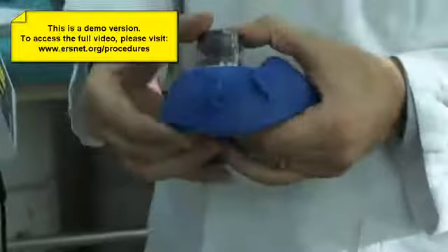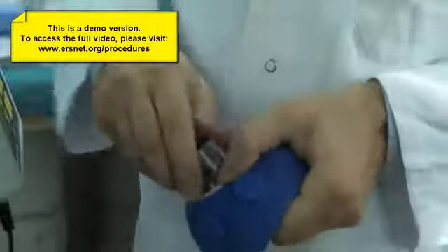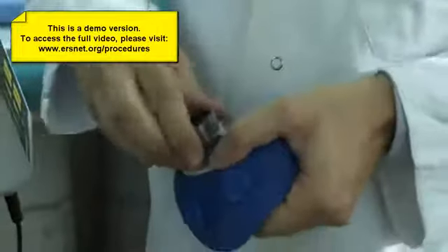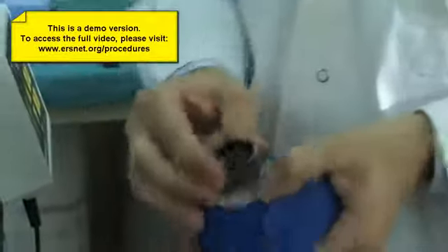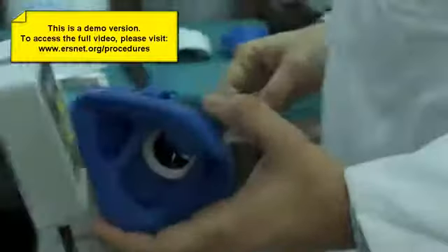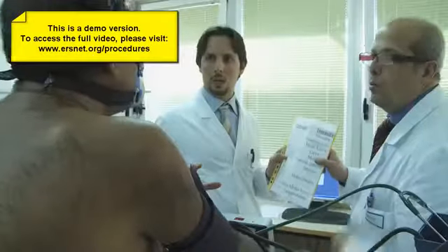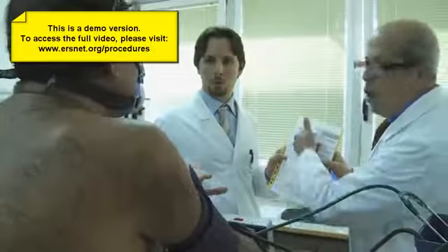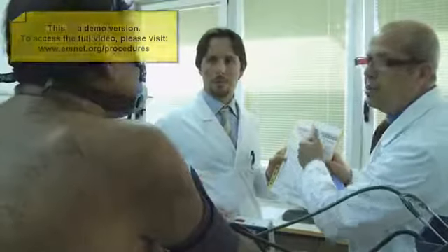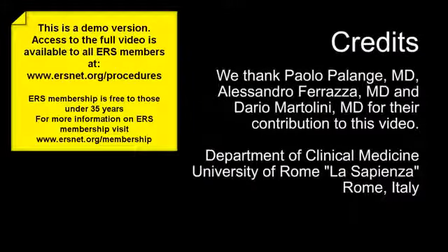Additional equipment needed during the test includes a mouthpiece or nasal mask that routes all inspired and expired gases through the flow device, and a Borg scale to quantify the patient's exercise-related perceptions of dyspnea and skeletal muscle effort.